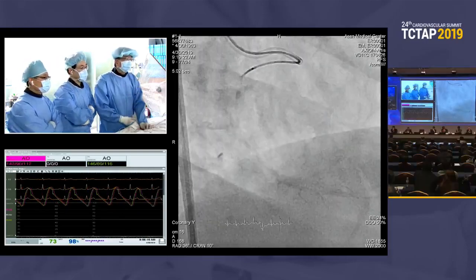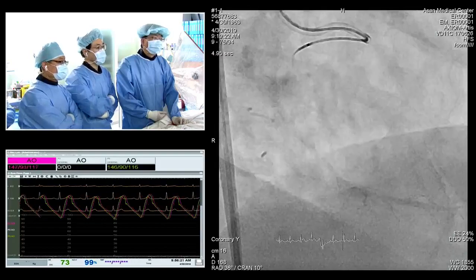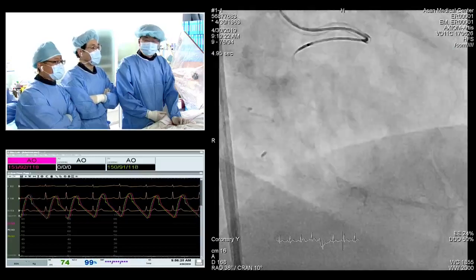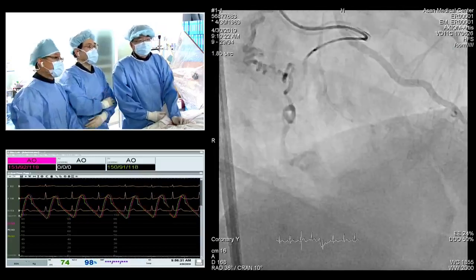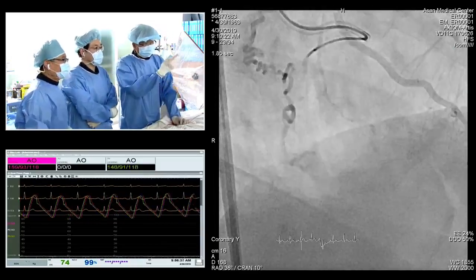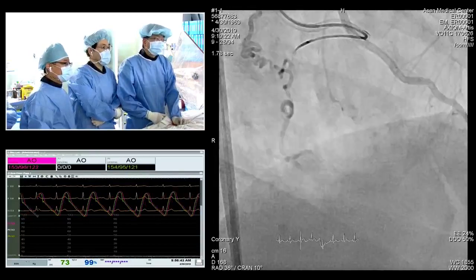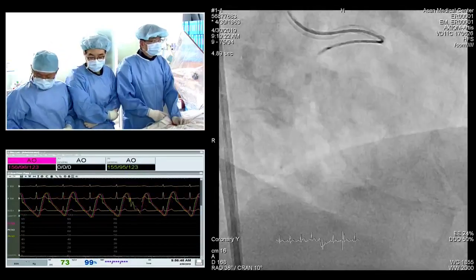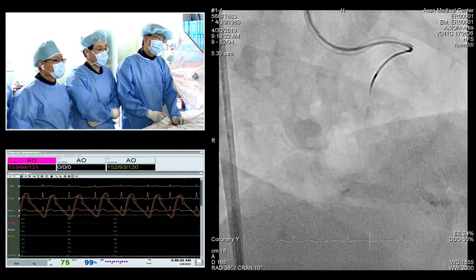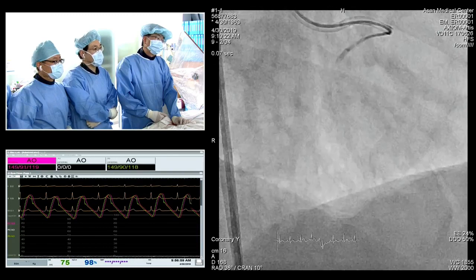So could you see the proximal cap clearly? With slow motion, you can identify between two different views where to navigate. Recently my visual acuity decreased, so I cannot see exactly. Anyway, around the side branch, you can see some stump-like projection. You can see? Slow motion, please. Slowly. Is it possible? Okay. Yeah, slowly. There appears to be a channel, so careful observation is needed. First option maybe XTR or.